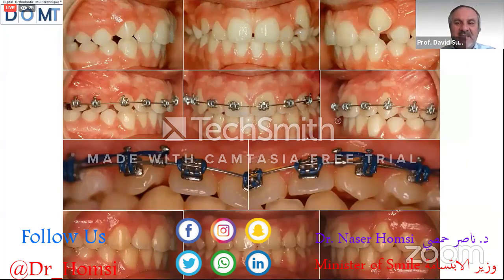Okay, another patient. The main problem of this patient is the class 2. First step, distalize the first molar. Second step, close the space of the premolar and canine.